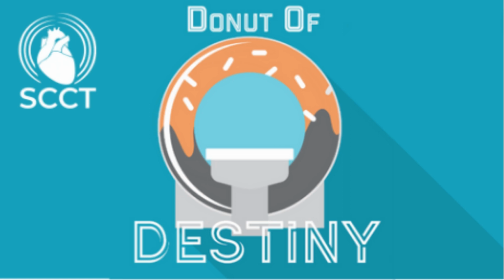Right, Nidhi? Briefly, for review, FFRCT is a non-invasive technique to estimate the hemodynamic significance of a coronary stenosis. The most popular FFRCT technique is the 3D computational fluid dynamics based solution from HeartFlow. This is the only FDA approved, CE marked, and commercially available technique to date. The HeartFlow solution is the FFRCT method that is used in the ADVANCE registry. That's right, Praveen. What exactly is the ADVANCE registry?